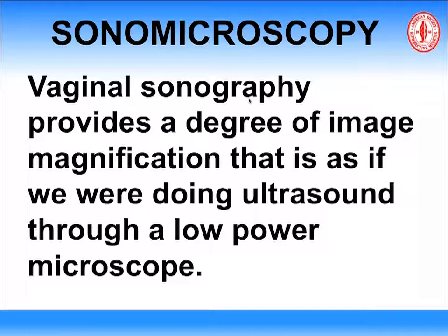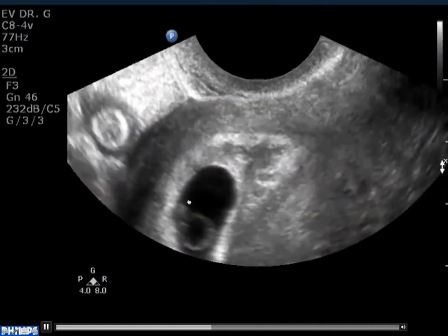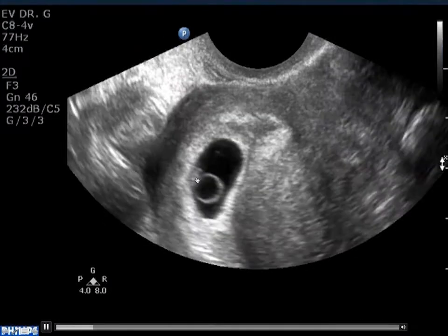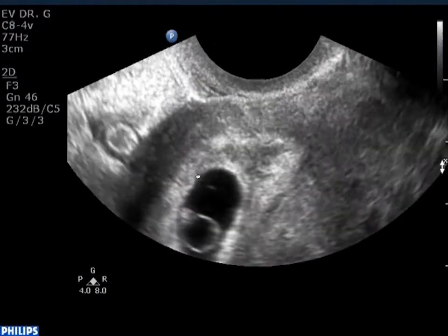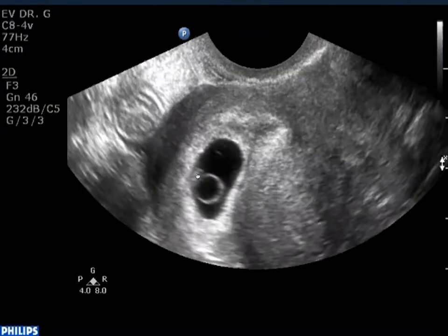We are seeing things with our ultrasound that you could not see if you could hold the structure in your hand at arm's length and squint at it. So for instance, here is a 3-millimeter embryo at 45 days from the last menstrual period attached to its yolk sac, in which you can clearly see cardiac pulsations. And my point is, if you had a way to hold a 3-millimeter embryo in your hand at arm's length squinting at it, you would not appreciate cardiac pulsations contained within a 3-millimeter embryo.